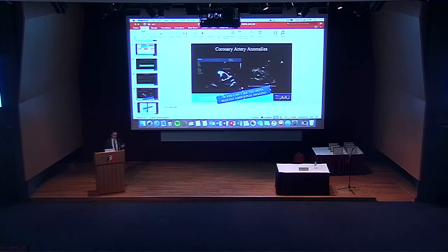16 to 19% of sudden cardiac death in athletes can be related to anomalous coronary arteries, and I don't think it's really been touched on in this talk and the previous talks. Echocardiography is absolutely fundamental at identifying the ostia of the left and right coronary arteries. You often see these. In fact, I'd say in over 90% of athletes, you will see the ostia, and you've got to make sure they're there. This is a right ostia, this is a left ostia.